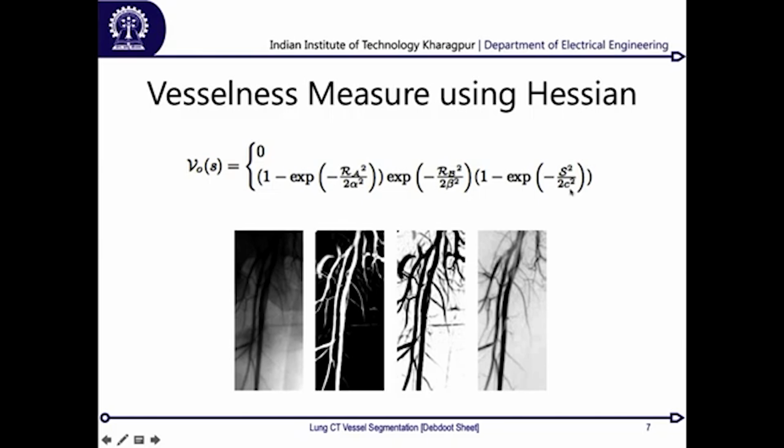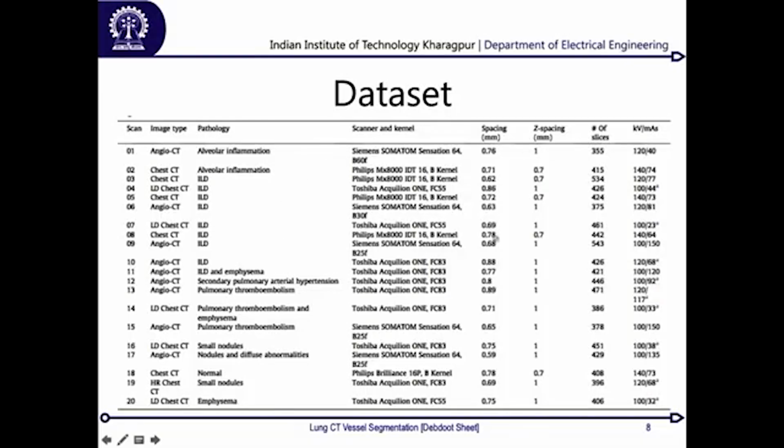Now this has been the state of the art for long. Since 1998 till 2012, when this challenge got announced, this was the state of the art. But once the challenge got announced, what they did was quite interesting. Since we have this problem of changing across vendors and changing across hospitals, as imaging instruments keep changing, their resolution changes, their operating behavior changes, and as a result, all of your image analysis problems trained on one domain become a major challenge to make work on another domain. And for medical image analysis software development, this is one major issue which you will have to take care of.